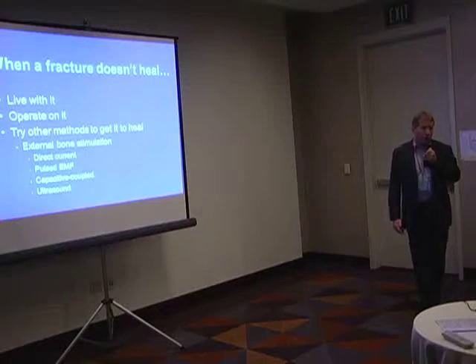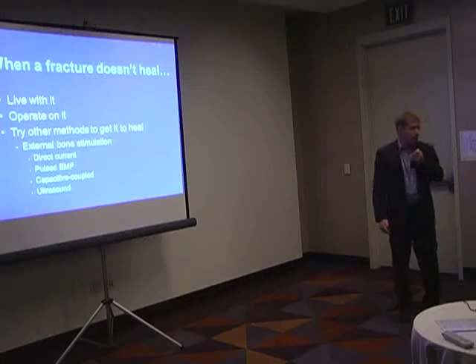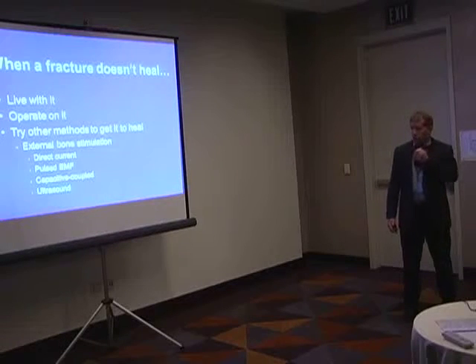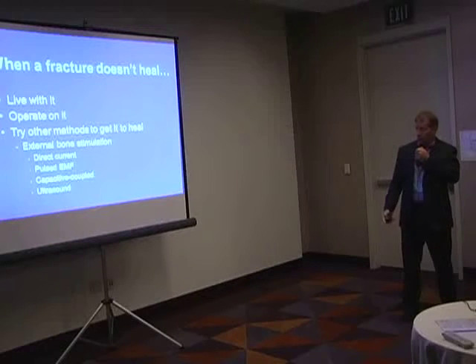Sometimes the patient trades one problem for an even worse problem if there's a complication. And so certainly non-invasive ways to get fractures to heal are of potential importance. And there are many different methods to this. There's ultrasound, there's extracorporeal shockwave therapy, and then electric bone stimulation.